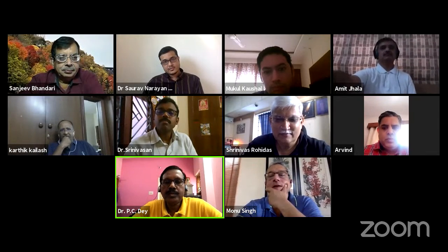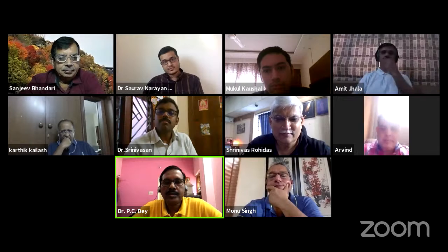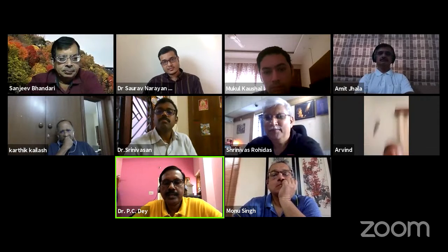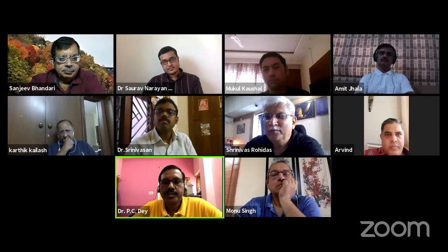So initially, it took more than an hour, 1 hour to 1 hour 30 minutes. But later on, a single level unilateral disc took 25 to 30 minutes. Initially, I took the L4, L5 and L5S1 left side. I start with the left side because the left hand holds the suction tip and the right hand the operating instrument. So I took the left side first.